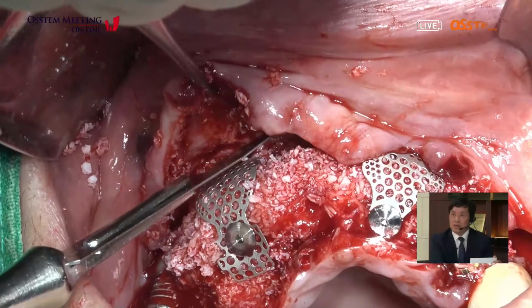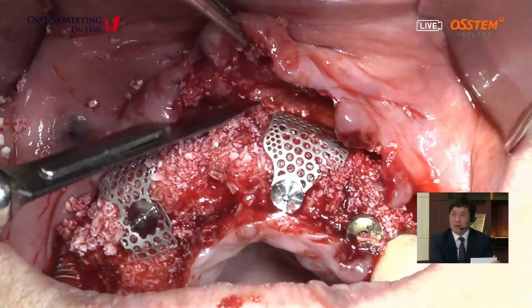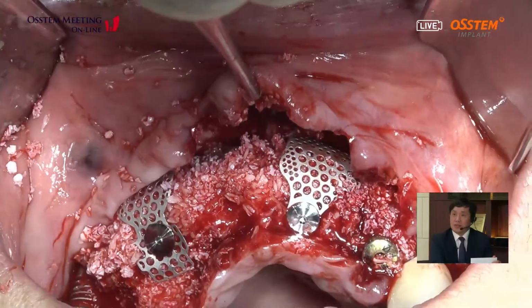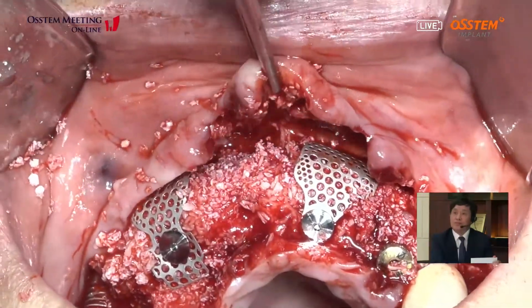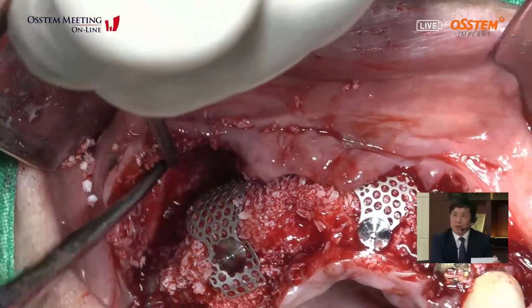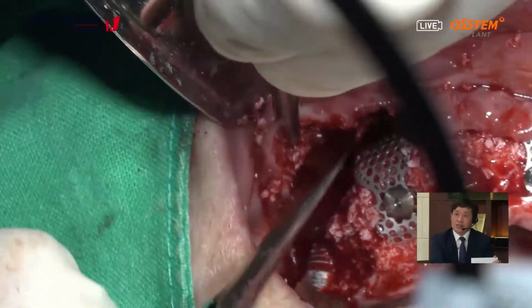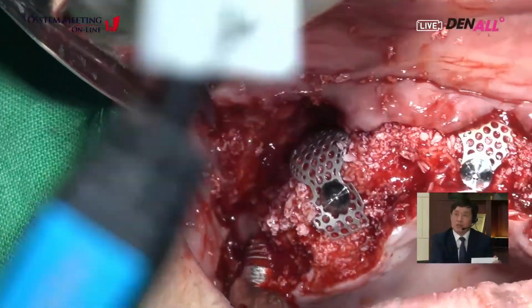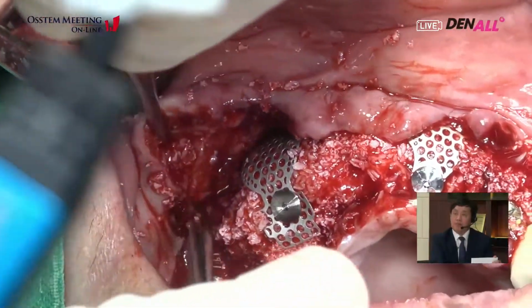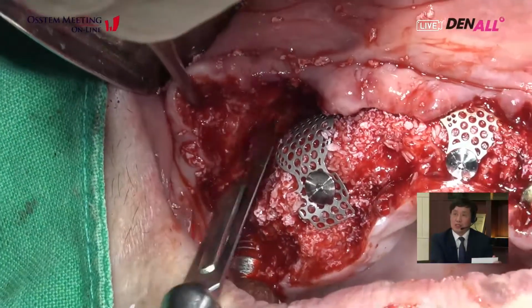He did the periosteal releasing incision with a new knife blade, and then for more advancement, dissection in the submucosal layer. He did the dissection for releasing of the labial flap, along with subperiosteal releasing.